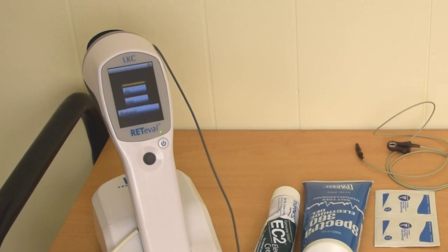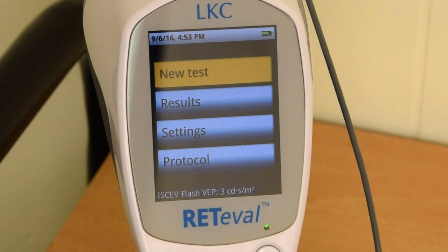Before running your VEP test, you want to make sure that you are using the correct protocol. Check the bottom of the screen to confirm the protocol you are using is correct. Once you have confirmed the correct protocol, you can start the test.